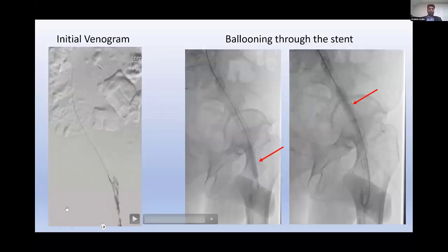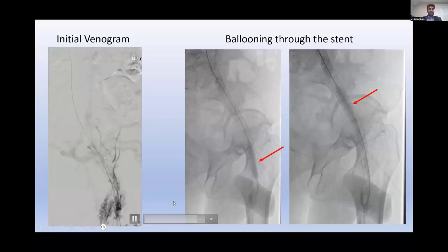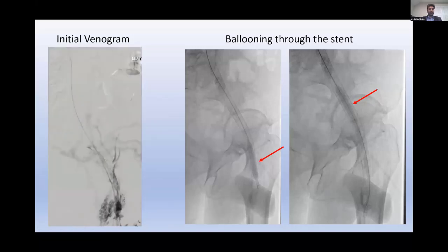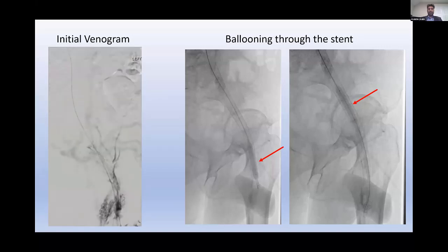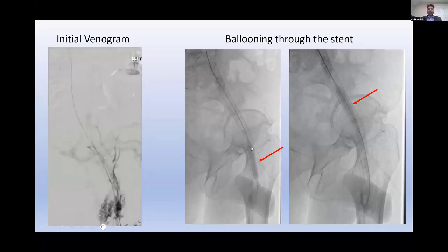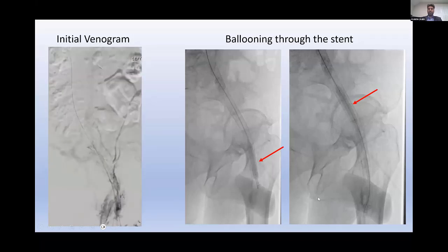The initial venogram from below the stent showed exactly what you would expect — nothing going through the stent, cross-pelvic collaterals, and eventually reconstituting the IVC. Once the wire was in place, I needed to create a channel. I ended up using an 8-millimeter balloon to create that channel, and various images show me doing that.